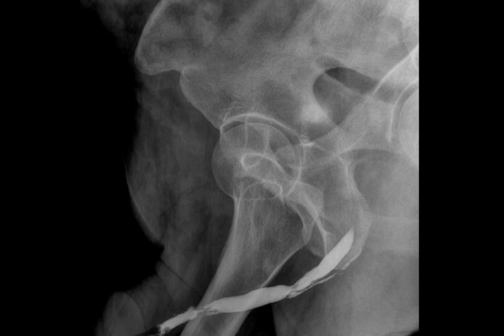And you slowly, gently push the contrast. You confirm that there is no contrast leaking into the peri-urethral tissues. And then you progress slowly, you push more and more to see as much as possible of the urethra. If you've seen up to the membranous urethra, okay, there is no problem, then you can proceed more for entire urethral imaging.